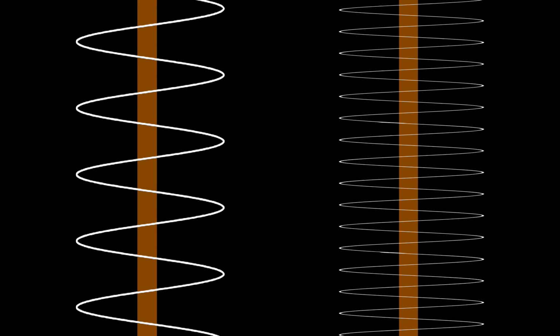Axial resolution, or the ability to tell that two objects, one in the near field and one in the far field, are actually two objects and not blurred into one object, is based on your frequency. Higher frequencies allow the sound beam to interact with the tissue more frequently, allowing you to differentiate axial resolution much clearer than with a lower frequency as displayed on the left of the screen. Axial resolution will always be greater than lateral resolution.